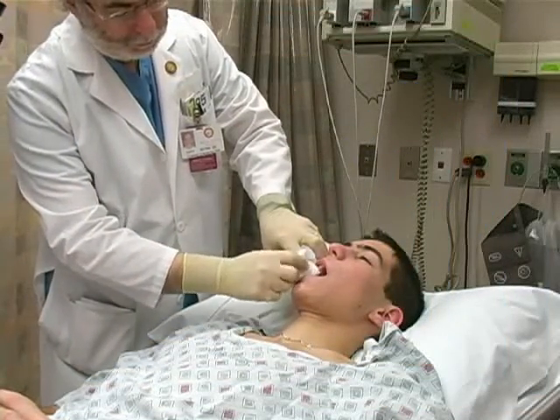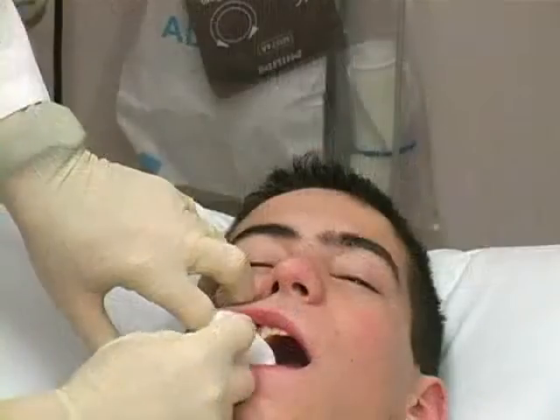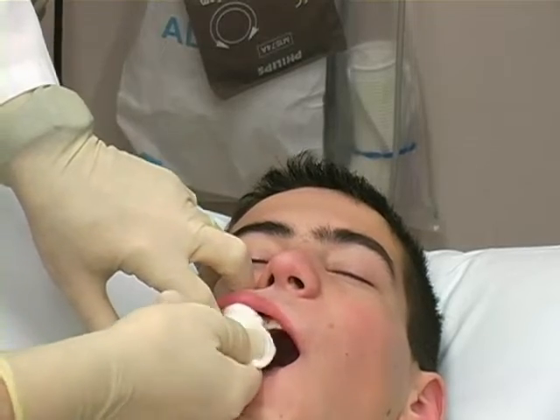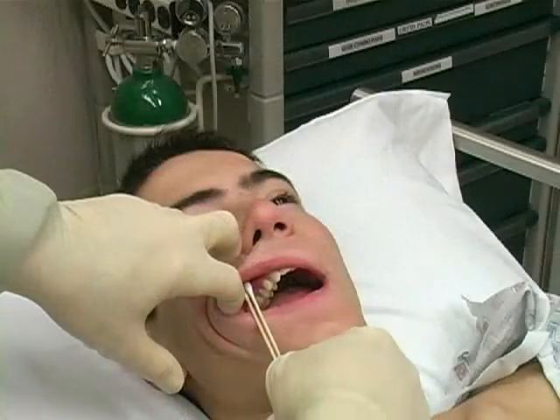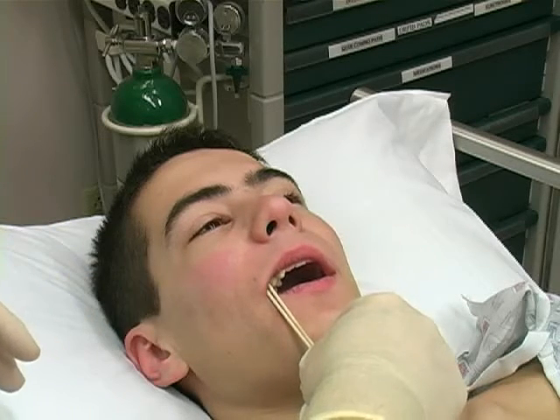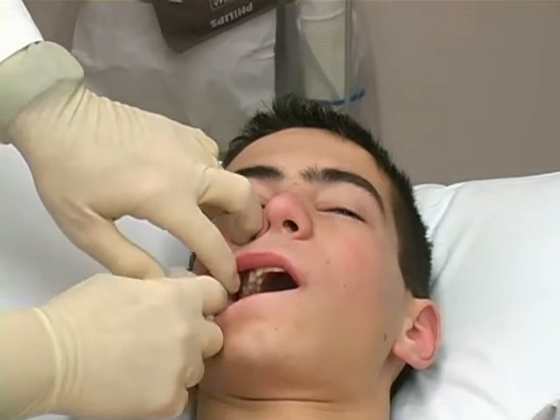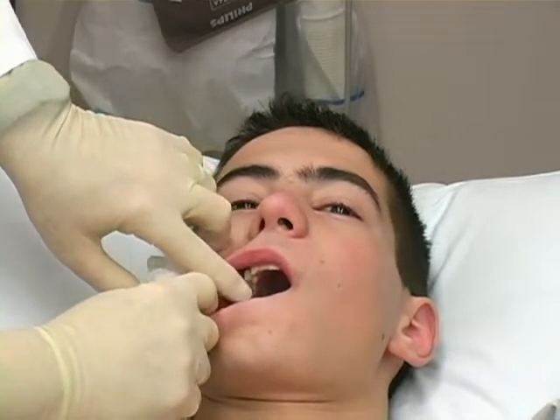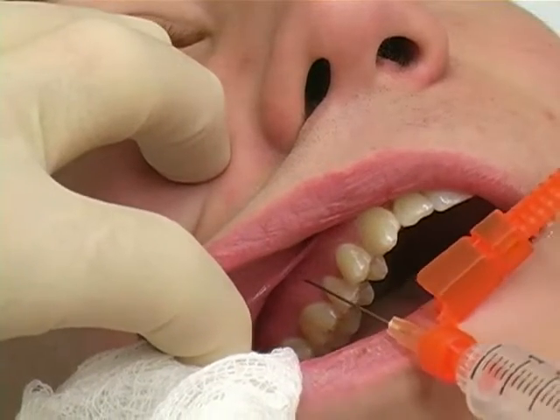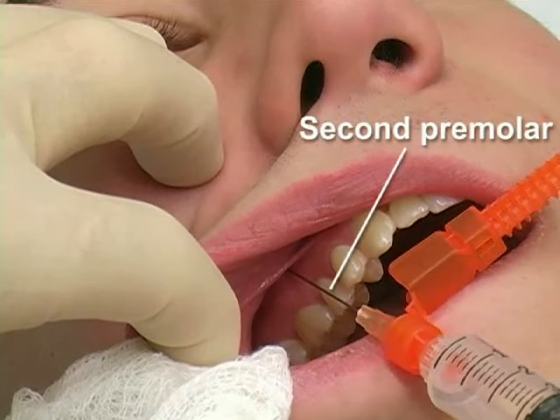Begin by applying a topical anesthetic to the superior buccal mucosa. First, dry the area with gauze to prevent saliva from washing away the anesthetic. Then, apply a topical anesthetic, such as benzocaine, to this region. Continue to palpate the foramen and use a piece of gauze to retract the lip and expose the mucobuccal fold. Insert a 3.5 centimeter 25 gauge needle into the mucosa opposite the second premolar tooth.